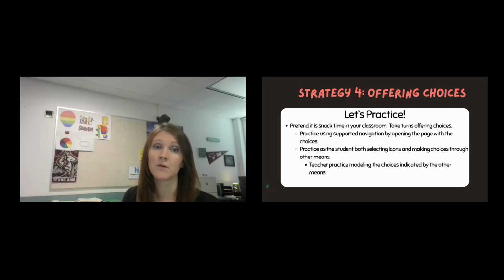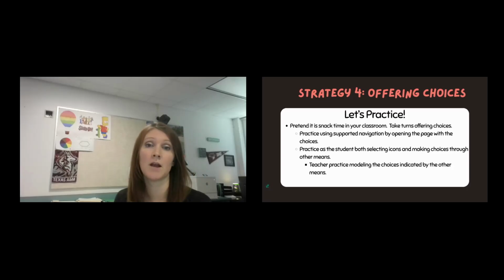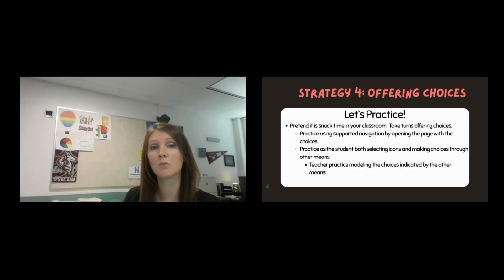If you have a partner, or if you want to practice with one of your students, however they make choices, you can practice modeling the choices that were indicated by other means. Maybe it's a choice of leisure activities. Maybe it's a choice of toys, but you can support their navigation by opening that page to offer the different choices. And so this is a little bit difficult to do if you're by yourself.